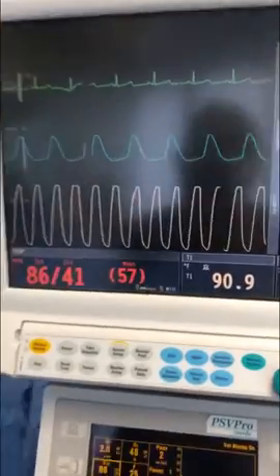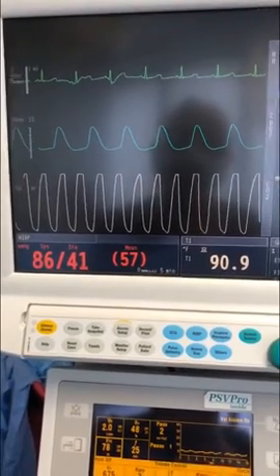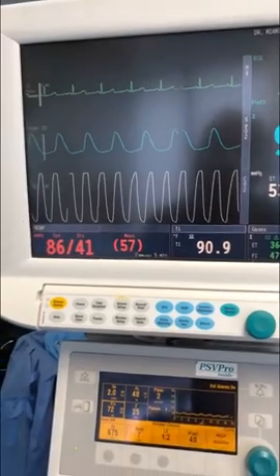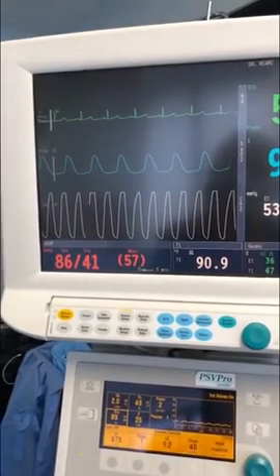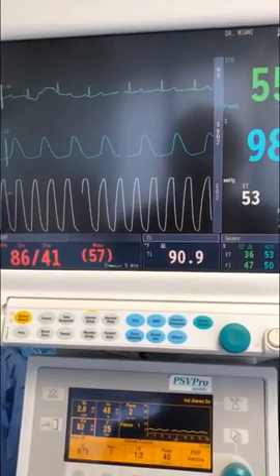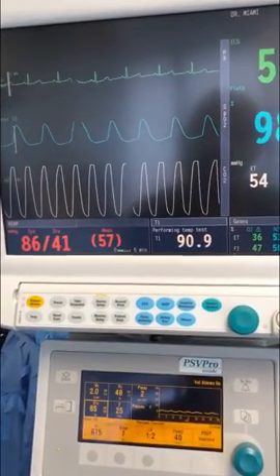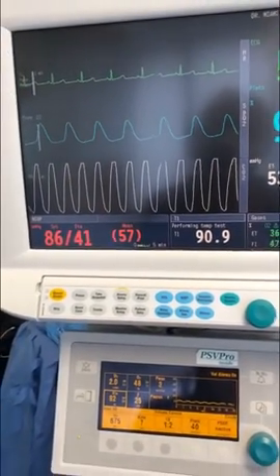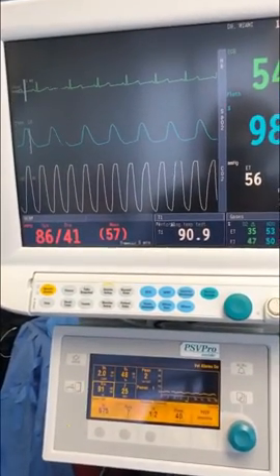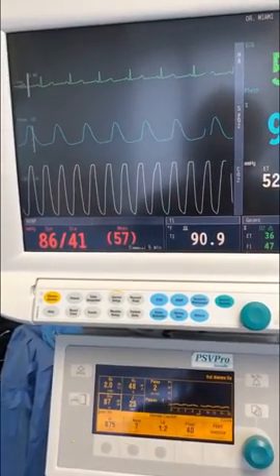So we are at the end of the case — it's been many, many hours. Part of the procedure was a tummy tuck, so I have to extubate this lady deeply. A deep extubation is actually pulling out the breathing tube while the patient is still under a relatively deep level of anesthesia, and then I have to support their breathing and assure that they continue to breathe so that they don't cough and move and bust stitches.